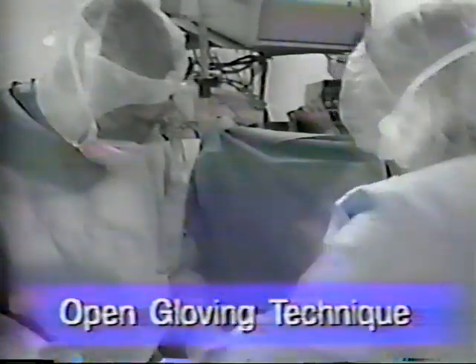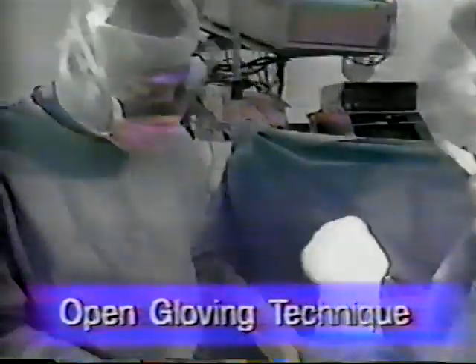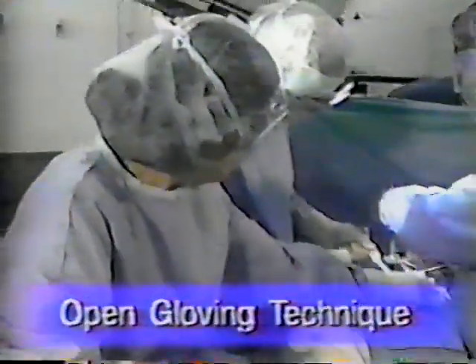The open gloving technique is used during a surgical procedure when one or both gloves must be changed without assistance. This technique is also used when performing sterile procedures, such as bladder catheterization or insertion of an IV cut-down. To change gloves during the procedure using the open gloving technique, the scrub person should step away from the sterile field.